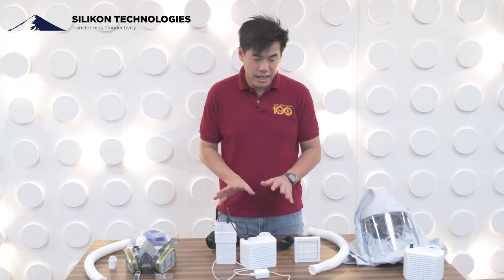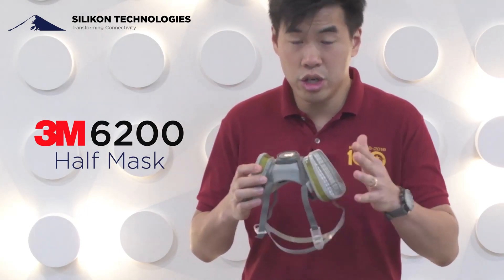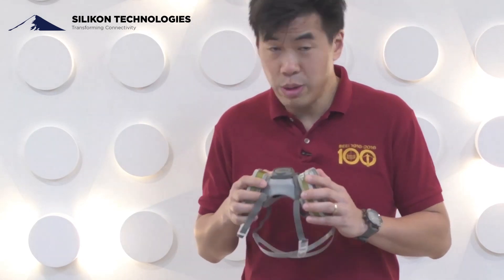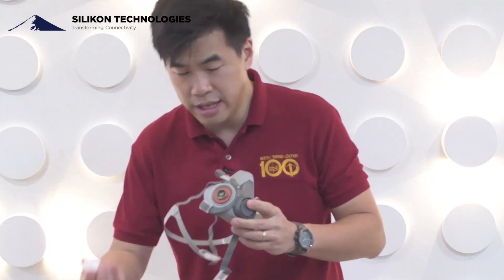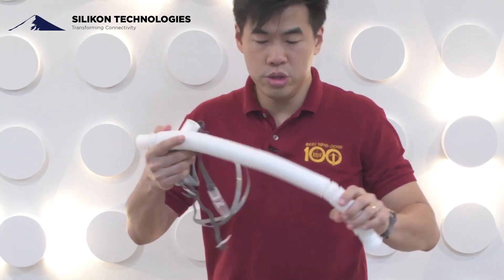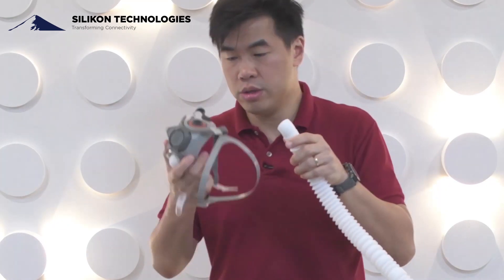We specifically designed it for both a hood version and a full half-mask version. What I have here is a 6200 series 3M half-mask with NIOSH filters. To use it, you remove the NIOSH filters and connect the specially designed adapter we've built, plus an adapter cap for the other side. You then connect it to a stretchable hose — depending on the function, you can use it longer or shorter — and hook it up to the unit.